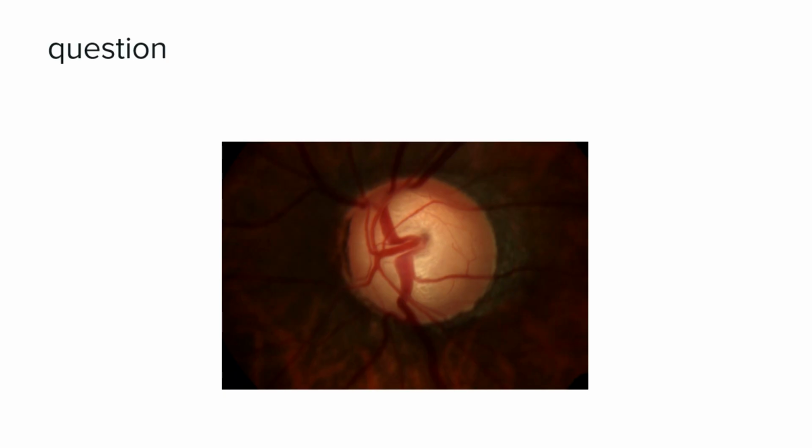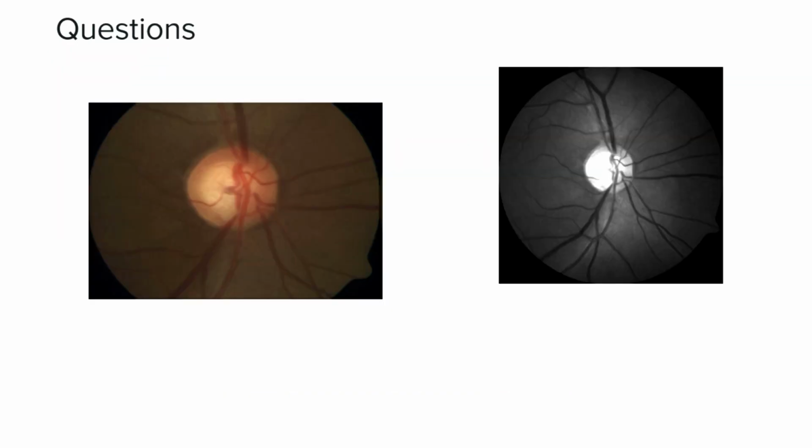Bayoneting is there. Can't make out the RNFL too? Yes, ma'am. In this picture, laminar dots, are you able to appreciate? You're able to see the pores, the lamina pores? Yes, ma'am. Okay, next person.